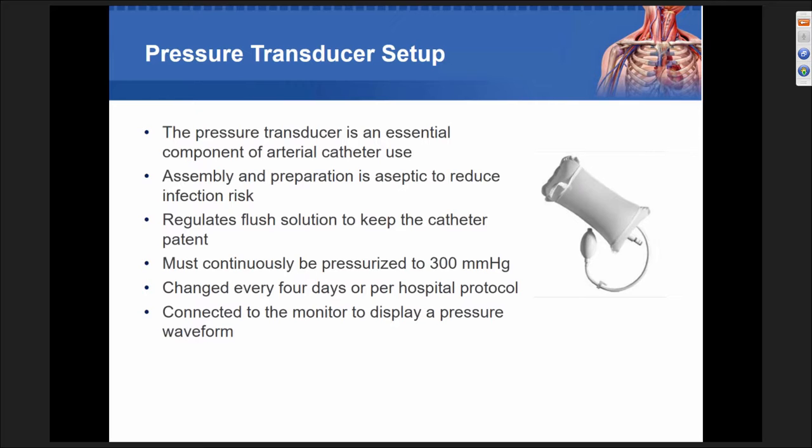It is changed every 4 days or per hospital policy. That is the actual recommendation from INS now, that it's changed every 4 days. And it's connected to the monitor and displays a blood pressure waveform. And we're going to talk about when you connect the monitor and don't have a waveform, or maybe when you have a waveform that doesn't reflect what the pressure is reflected in another device. So we'll go through that as we move forward through the slide deck.